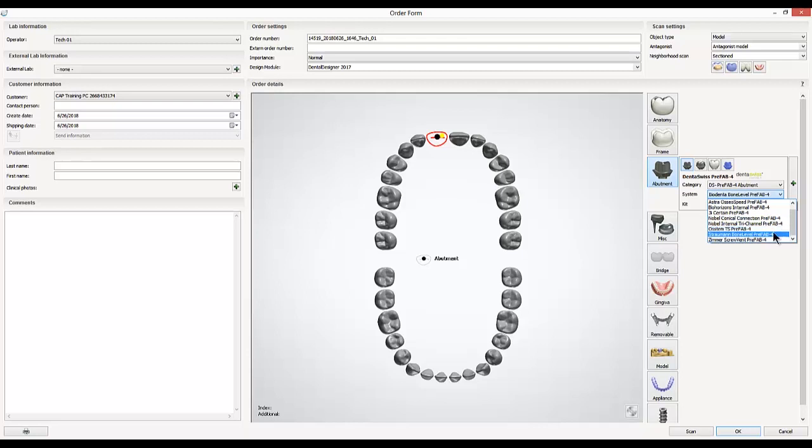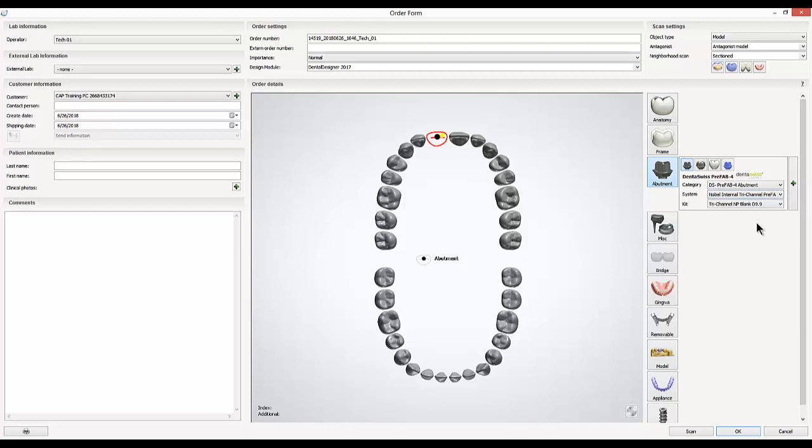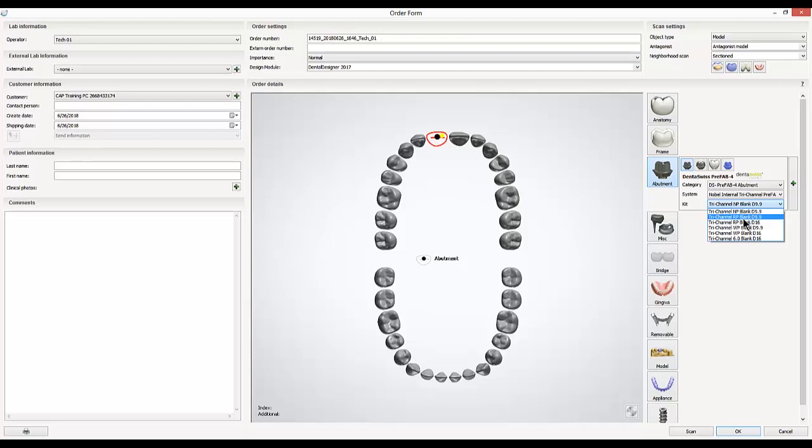You'll choose your system, which is typically which brand component you're working with. In this case, I'm using a NOBLE replace, so the NOBLE tri-channel. And then for kit, I'm going to choose specifically which size and implant parts I plan on using.